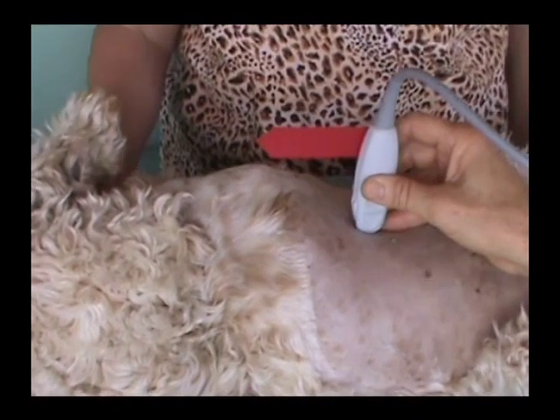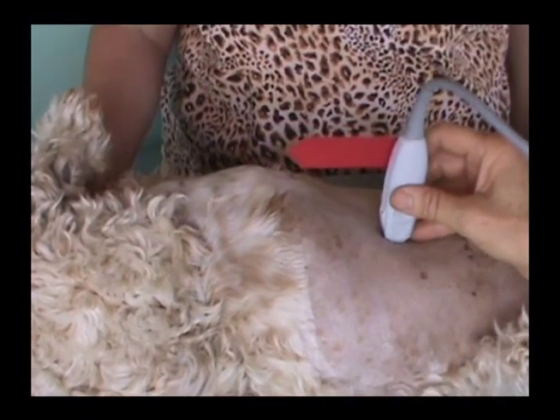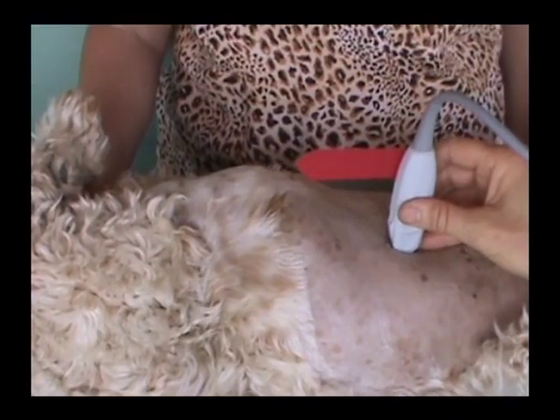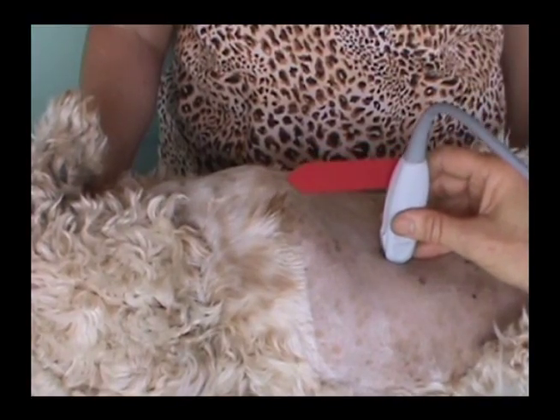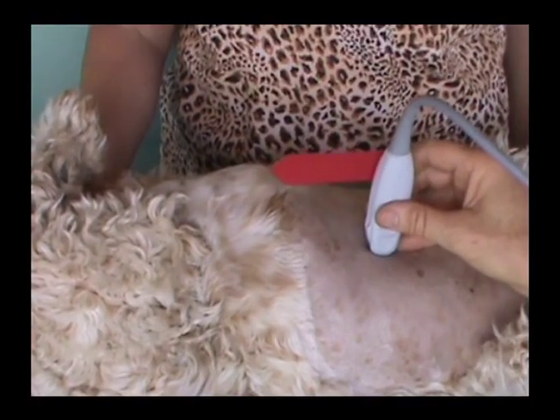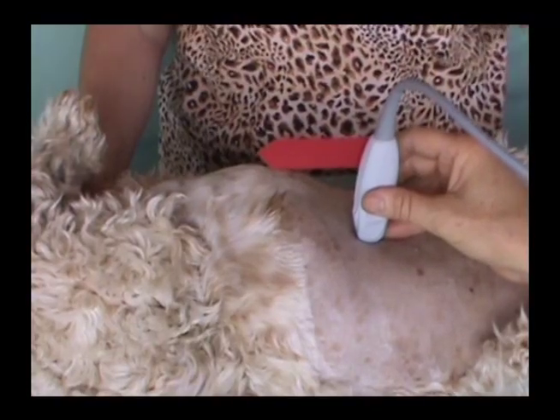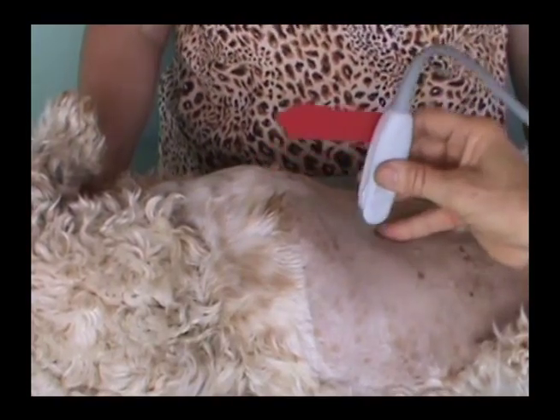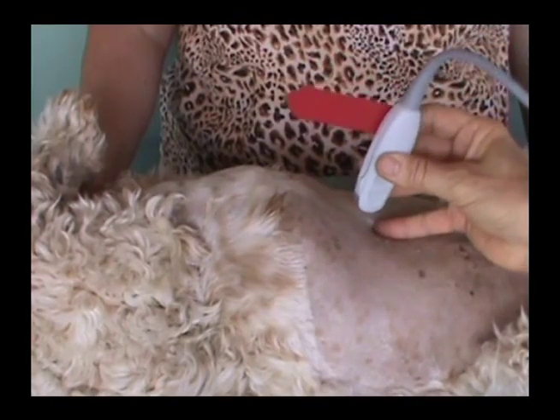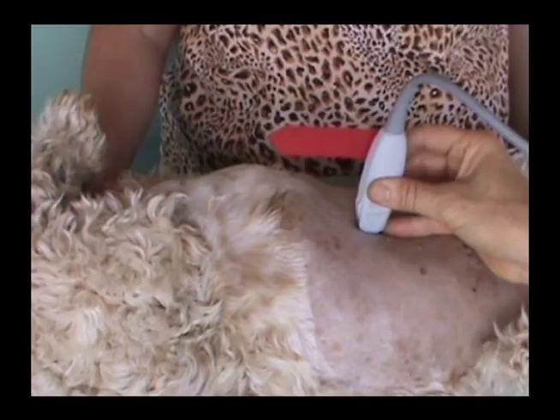Image drift is a common mistake everyone has to learn to correct. The sooner you learn to prevent image drift, the less frustrated you will be. If the image is drifting, it is because you are unintentionally moving the transducer. The best way to prevent image drift is to anchor your little finger to the patient's body, and then anchor the transducer to your little finger.